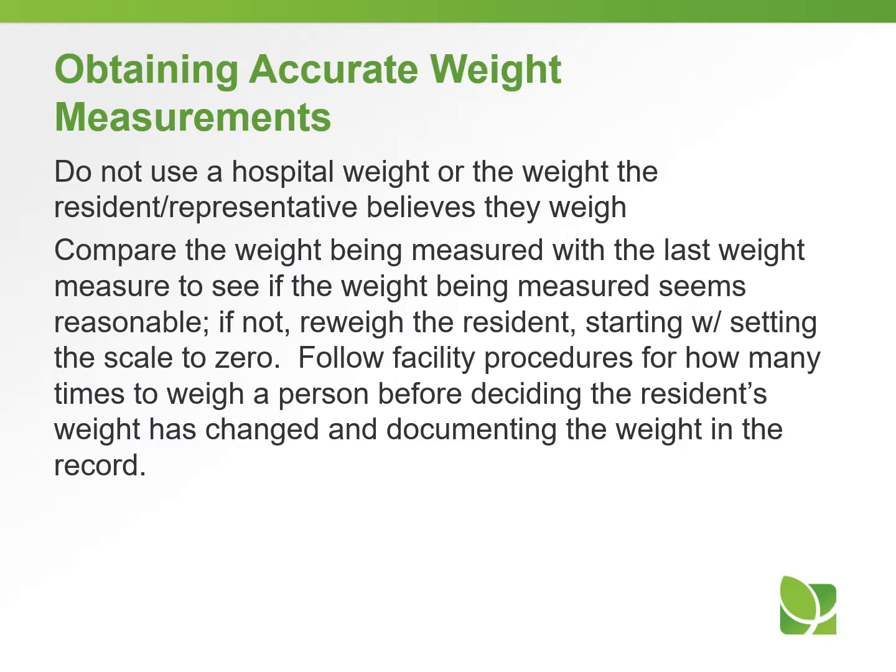Start with setting the scale to 0. Follow facility procedures for how many times to weigh a person before deciding the resident's weight has changed, and document the weight in the record.